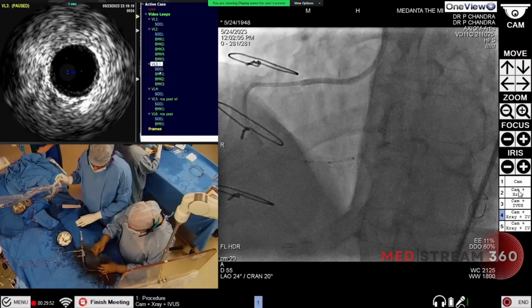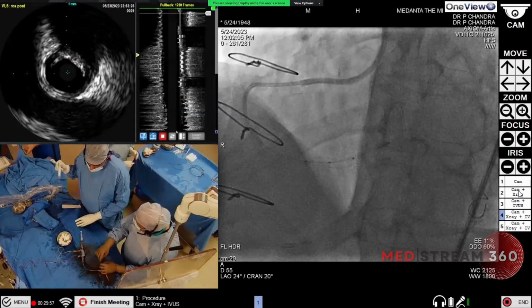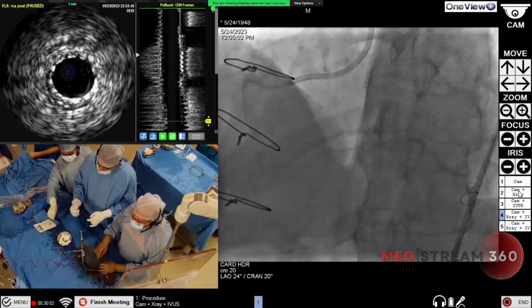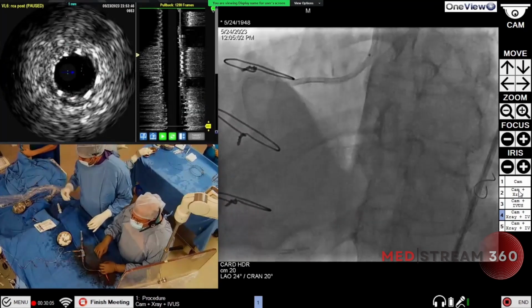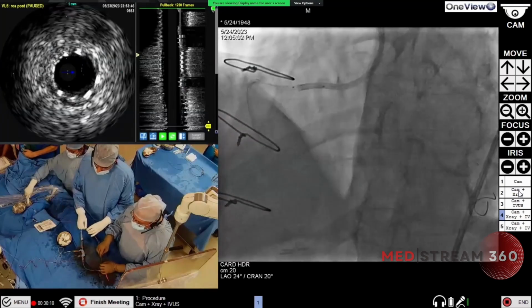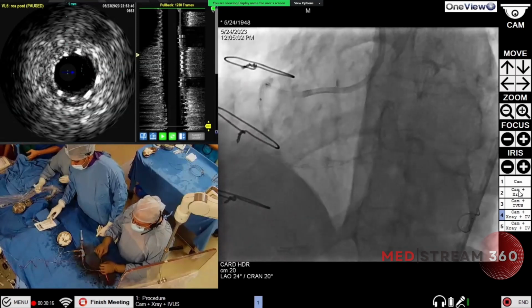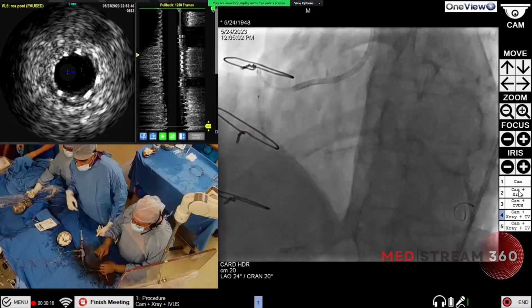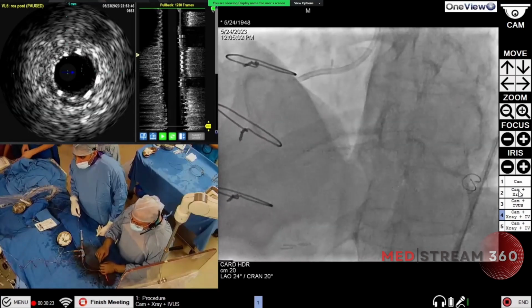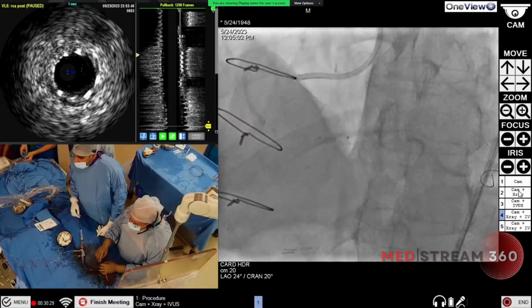So this case was a calcification in the distal part at the bifurcation with a tight lesion. Although this calcification was not very heavy, and some people may say that I could even do it without this, which is fine, it is always better because this patient had multiple treatments, previous CABG, 3 angioplasties in the past. So we must try to do a good job so that he doesn't come back again quickly.